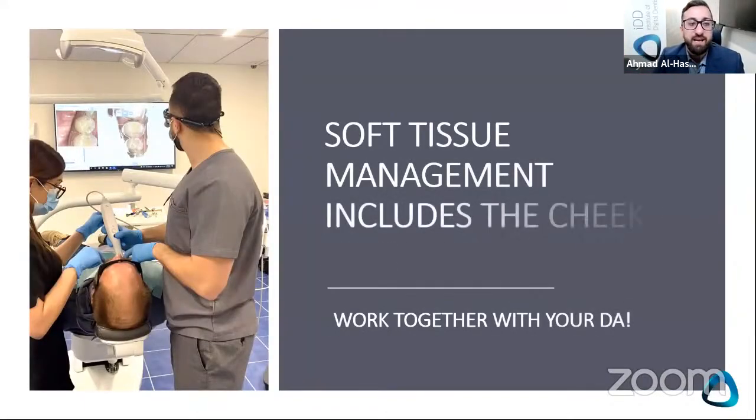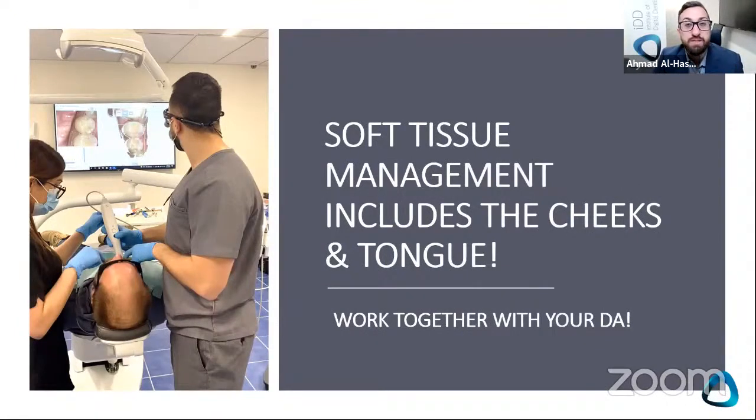And lastly, soft tissue management includes the cheeks and the tongue. It's not just about the little bit of gingiva around the prep. And work together with your DA, guys. Train your DA to know how you scan, know the style of your workflow. For example, in this picture, you can see what my DA is doing. She routinely does this. She retracts instantly.